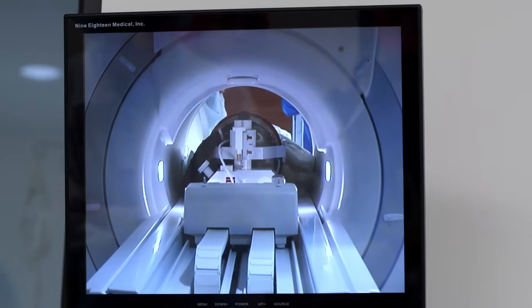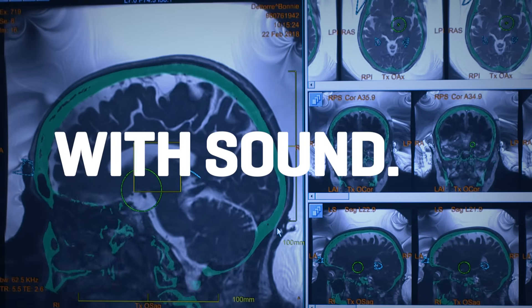This is the target for sonication. Let's write down the coordinates and we're going to go inside and move the transducers.